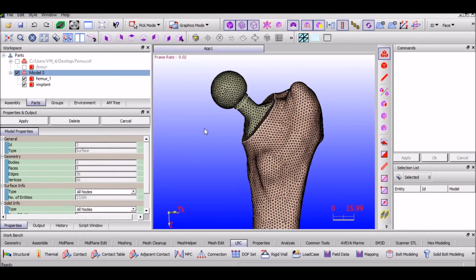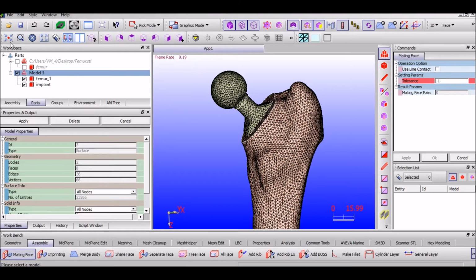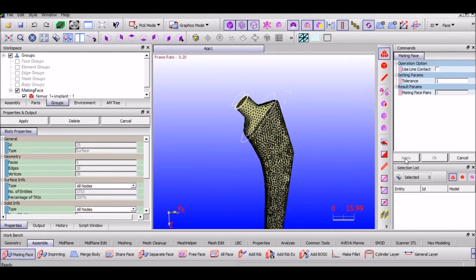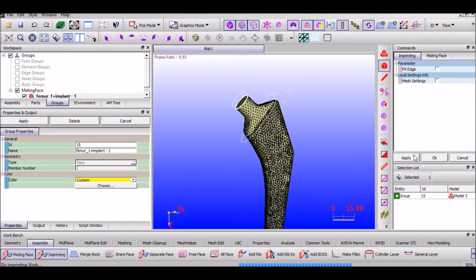Now that the body has been remeshed, the next step is face mating. Go to Assemble, Mating Face, select both the bodies and set the tolerance as 1. Click Apply. The operation has been completed successfully. Once face mating has been completed, the next step is imprinting. So under Groups, select the body under Mating Face, select Imprinting and then click Apply.